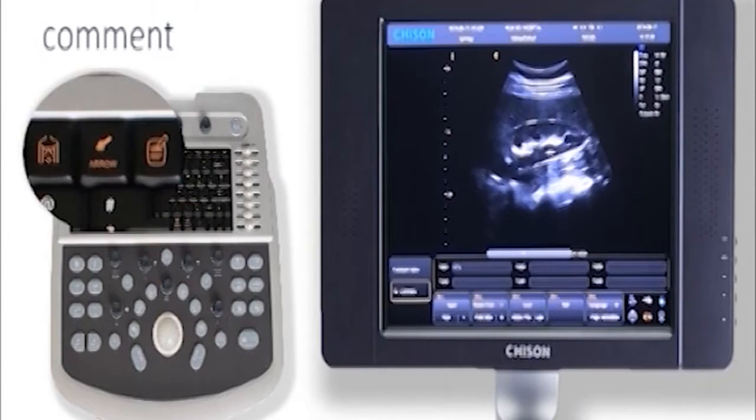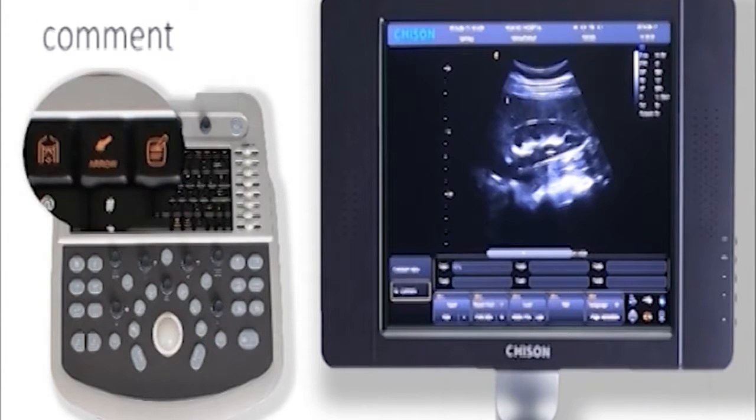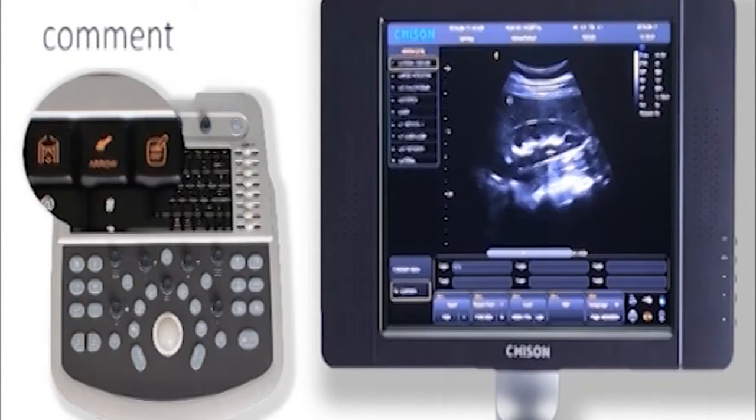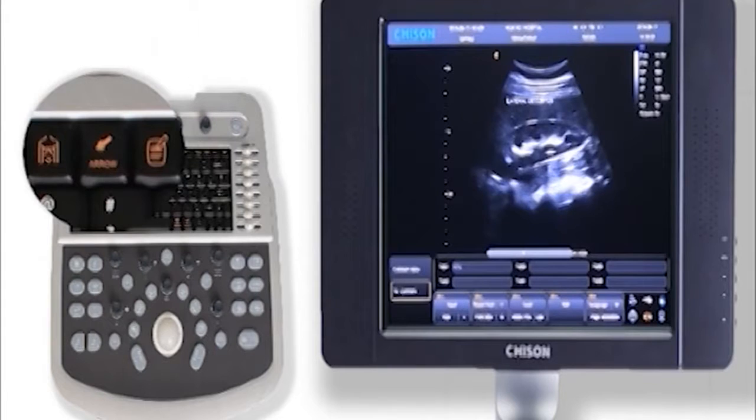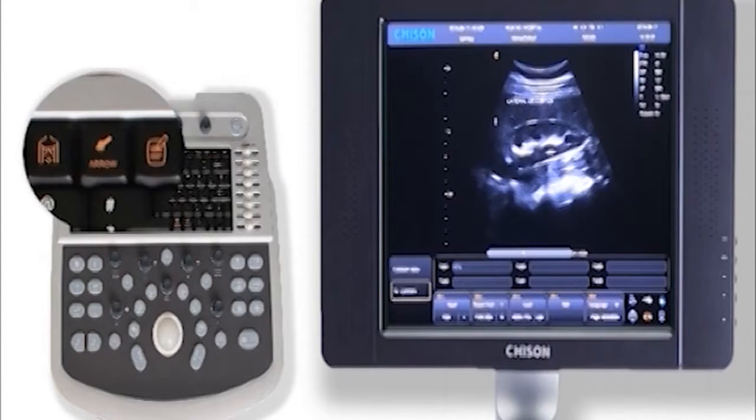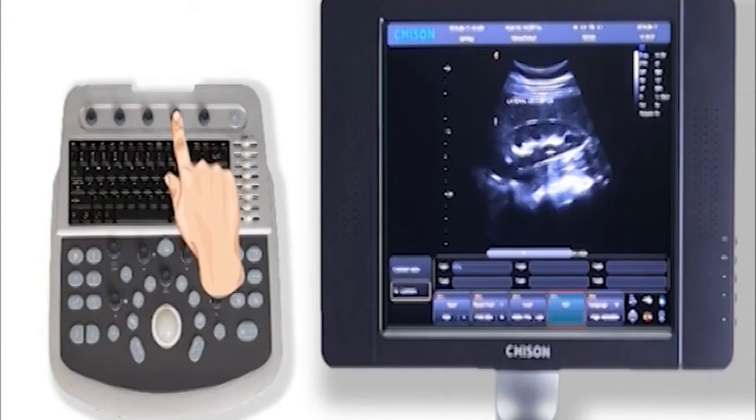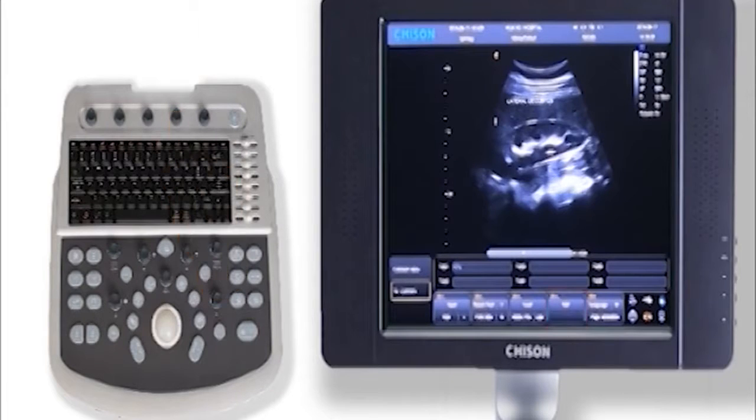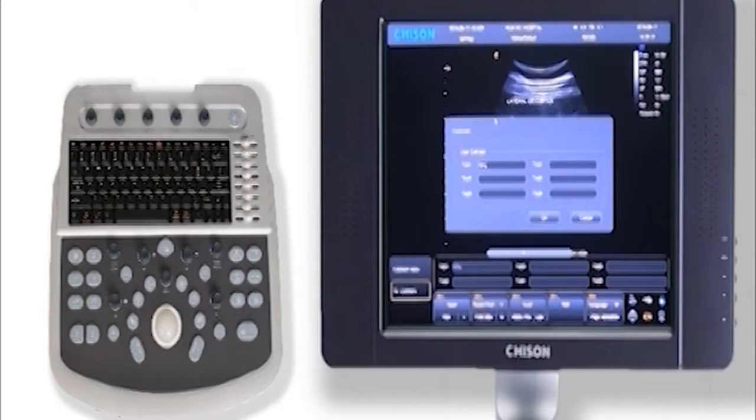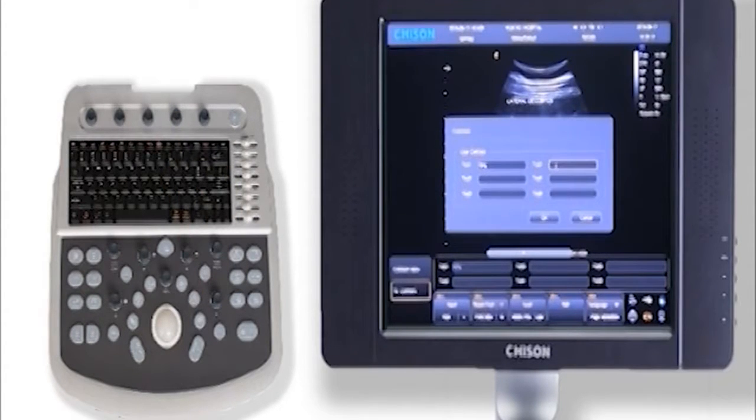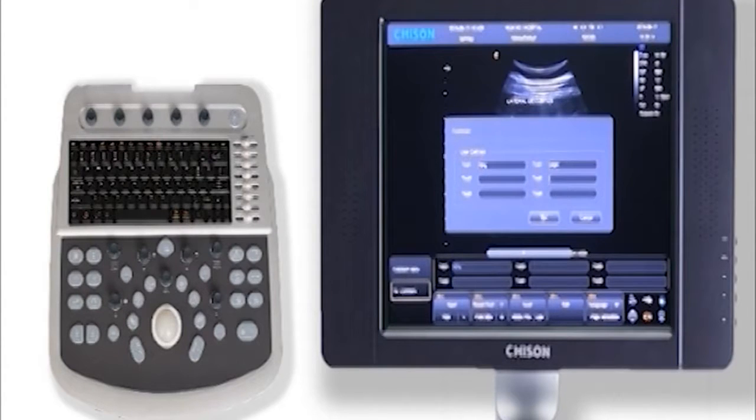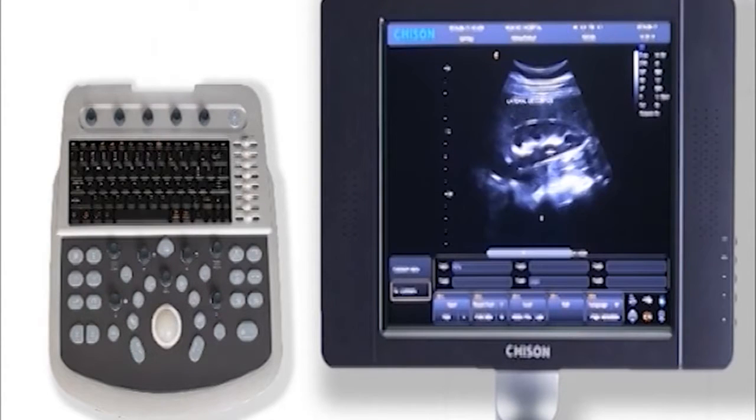This key is for comment. Press it, we can input comment on the screen. Also, we have quick comment. We can edit six frequently used comments. Next time we just press the knob to get the comment on the screen.